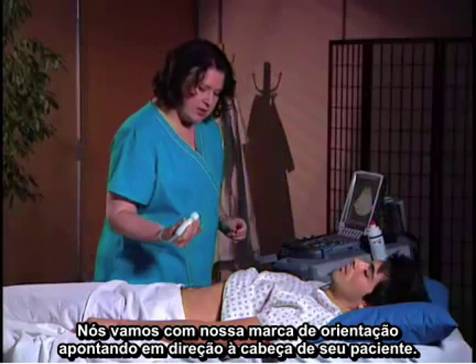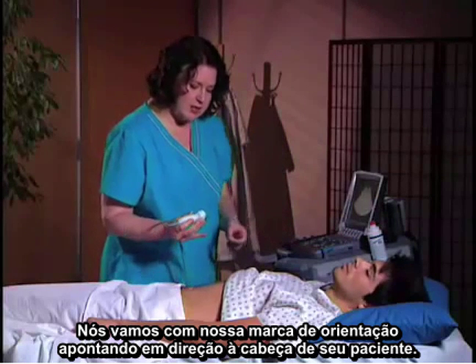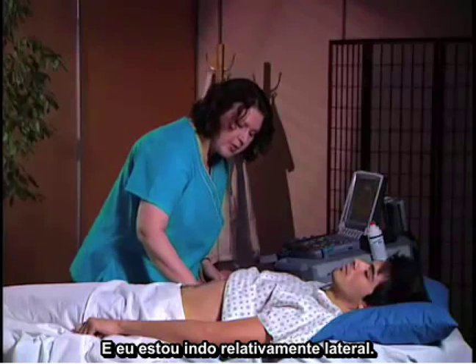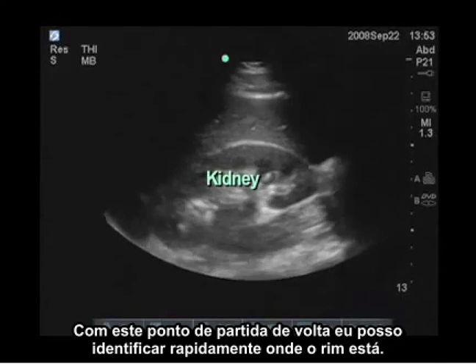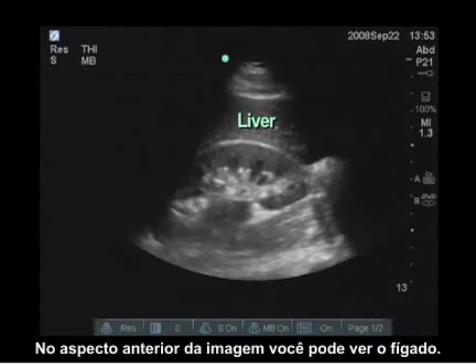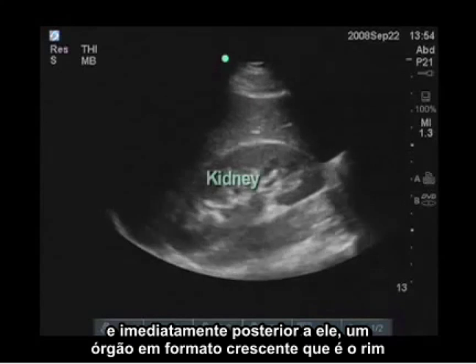We are going to go in with the orientation marker pointing to the patient's head, so this will be a sagittal view. I'm going to go in fairly laterally. With this starting point, I can quickly identify where the kidney is. In the anterior aspect of the image, you see the liver, and immediately posterior to that, you see a crescent-shaped organ, which is the kidney.